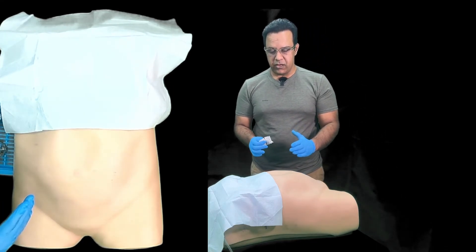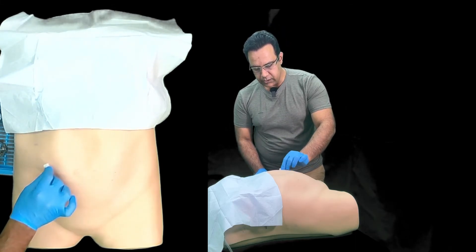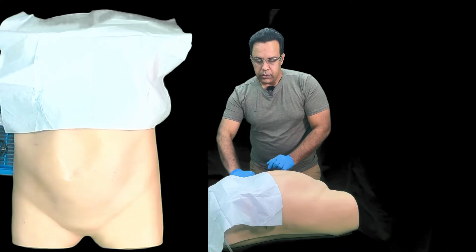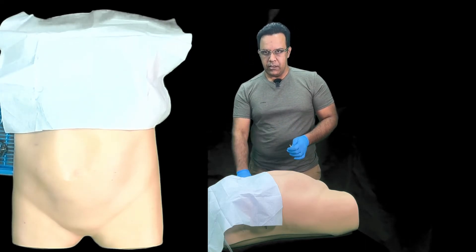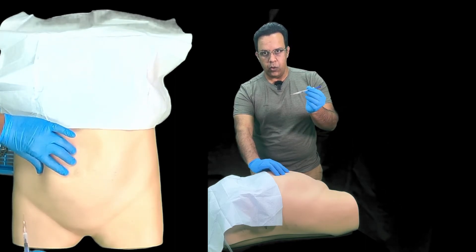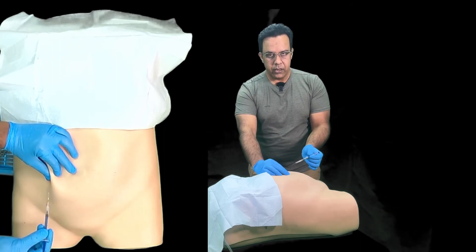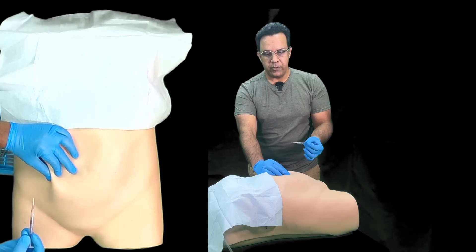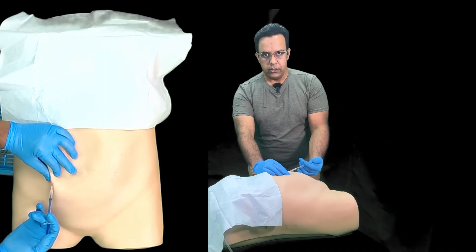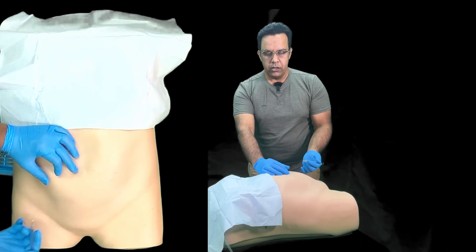Check the site for any redness, ulcer, or abnormality, and ask the patient if they have any pain — do not use that site. Clean the area in a circular fashion for 30 seconds, moving away from the center. Hold the skin about two inches between the thumb and index finger, hold the syringe like you hold a dart or pencil, pinch the skin, and insert at anywhere between 45 and 90 degrees. Warn the patient of a sharp scratch, inject the medication, and remove the needle.